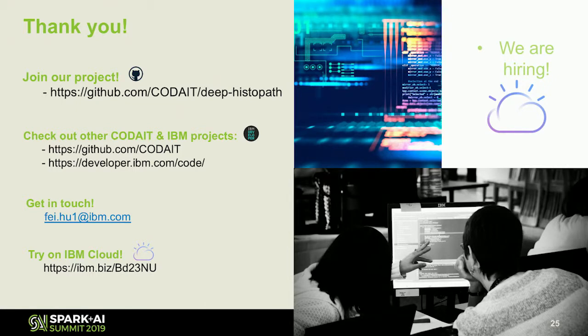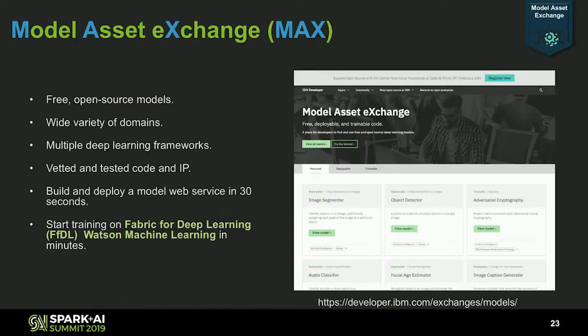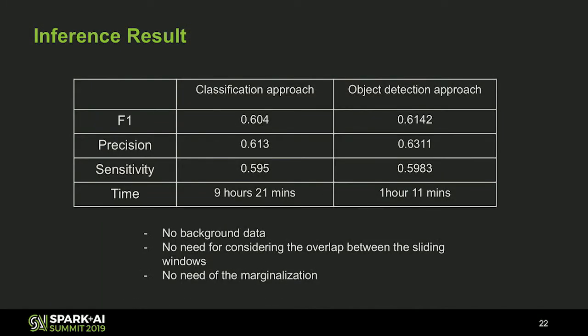So my question is, in one of your previous slides, one of the operations you mentioned was data smoothing. What was the purpose of that operation? So data smoothing basically is to cluster the prediction results, because the nuclei are very close to each other, right? And the evaluation uses a size of about 30 pixels to evaluate your prediction. So some nuclei are smaller than 30 pixels, so we want to combine this kind of prediction result into a single one. So we want to smooth the prediction result. Does that answer your question? All right, thank you.